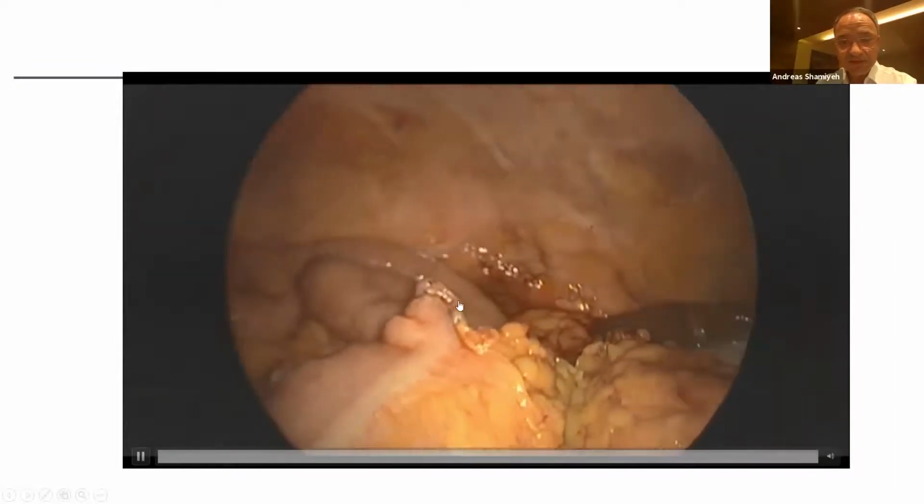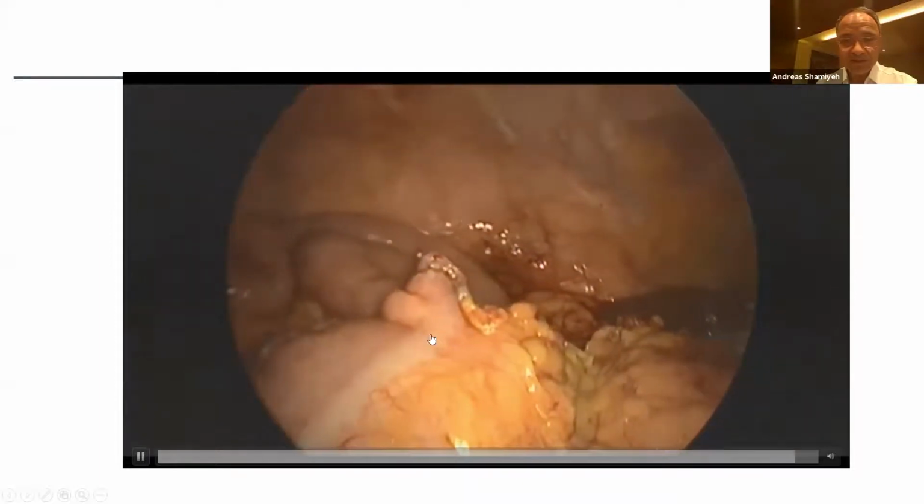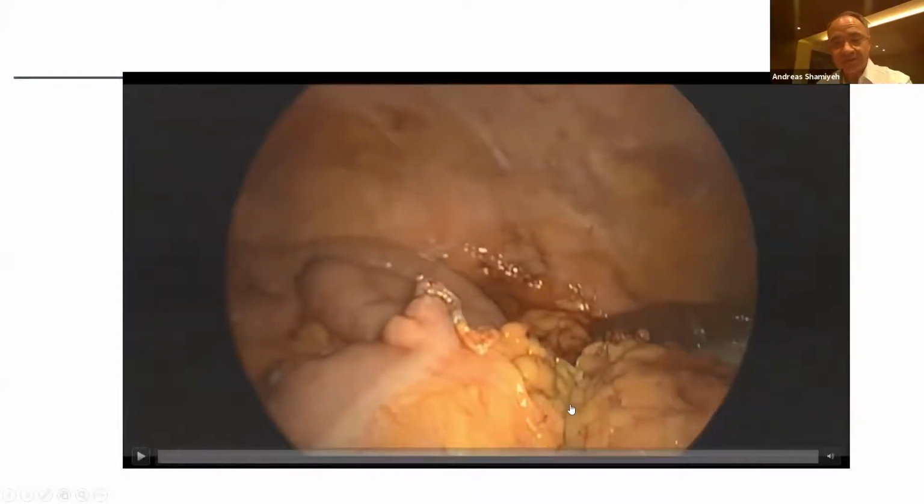If you just have not a good feeling and you don't use it routinely, just then check the anastomosis if everything is in a good blood supply condition, as you could see in the picture, in the video, that even the small bowel, this is an isoperistaltic anastomosis, and the large bowel are in good blood supply.